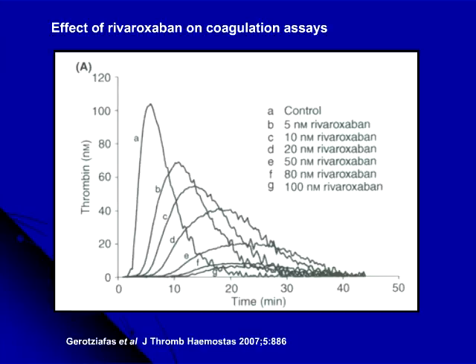There are many other assays, and I'm not going to go through them all. In the symposium book, I've indicated a table which summarises the effect of the thrombin and the 10A inhibitors on various laboratory tests. This is just an example of thrombin generation, which is obviously very popular at the moment. You can see a clear dose response between rivaroxaban level and thrombin generating potential. I don't know yet how this information would be useful to me as a clinician.